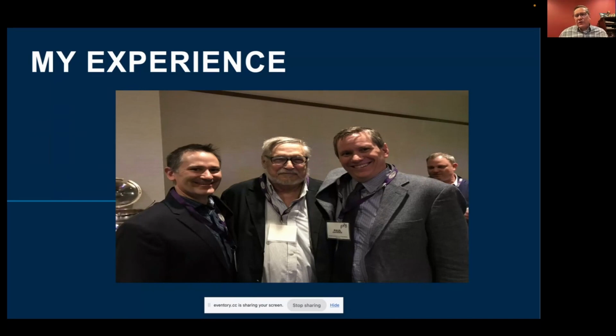Interestingly, when I was doing my fellowship with Art, it was in the early 2000s. And at the first talk, we heard a little bit about the evolution of the implants and the generations of total ankle implants from the first generations that really failed miserably, the second generation, which had a little bit better survivorship and success. And then now we're on to our third and fourth generations, which hopefully are more successful and giving us more longevity. When I was doing my fellowship with Art, it was right about the time when those second generation implants were starting to show some of their weaknesses.